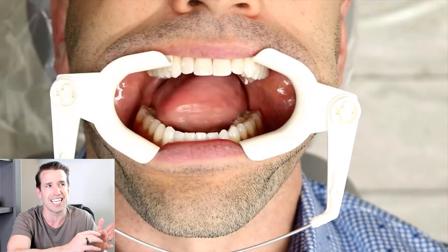The attachments are on — that is how easy peasy it is. Kind of like braces, attachments are on, and now we're on to the next part. So I'm putting on my first tray — I just have the top. It's pretty straightforward. I think I have like four, five, or six attachments on the top. Putting in the trays is relatively straightforward. I always tell people when they first put them in, you want to make sure you're pushing on really, really well. I like to grab something like a piece of Kleenex to bite on and kind of keep seating the trays, because you want the trays to really fit well to the teeth. You do talk a little funny when pronouncing certain T's and S's, but this is the very first day I've got them on — I'm sure it's going to get better.